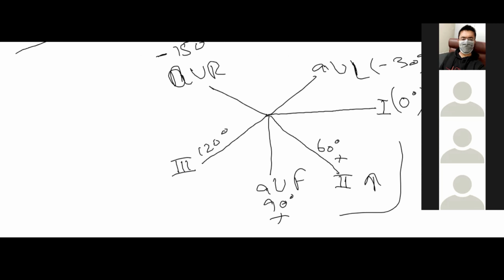Lead 1 will stay positive, but lead 2 becomes negative. And along with lead 2, lead 3, which was sort of isoelectric, will also become negative because the heart axis has been deviated towards the negative side.